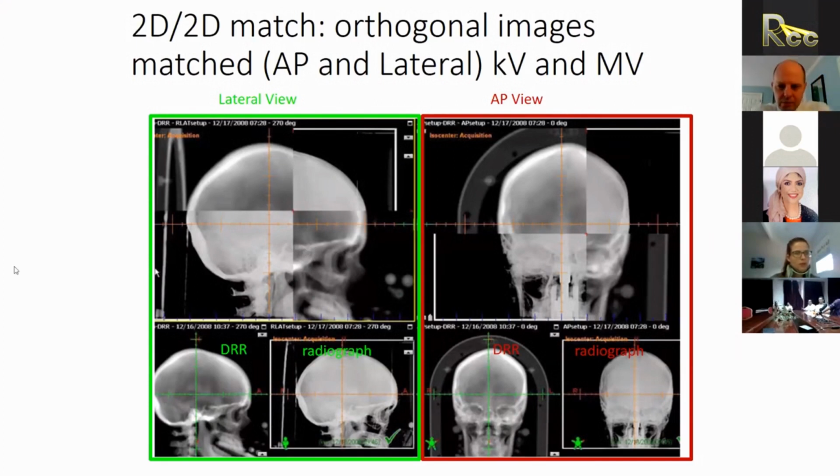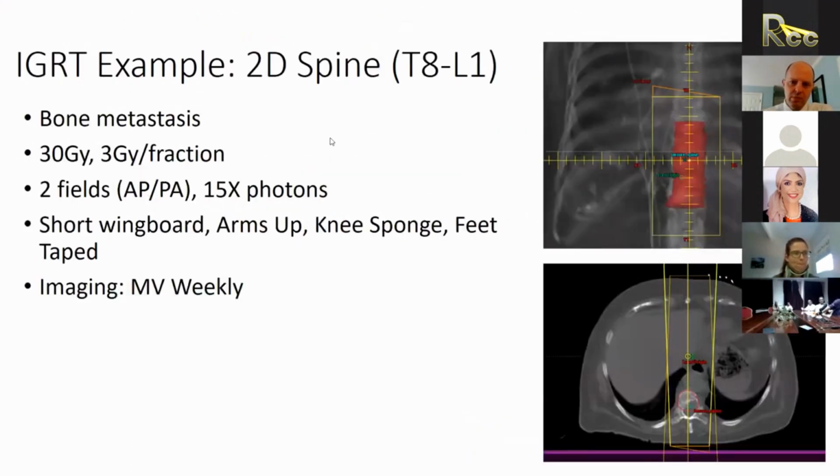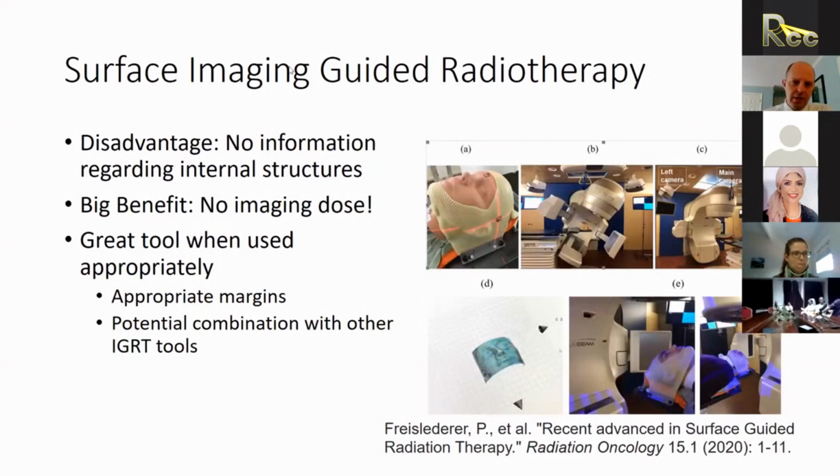Okay, Shaimat said, I didn't understand surface IGRT. What type of imaging do we take during setup, kV or MV? I think it's surface imaging. It's optical. Usually what happens is you can see this grid pattern. You have some sort of a grid that's projected on the patient from one light source, and then that's detected by an optical camera. It's not kV, it's not MV, it's optical. It detects the locations on the surface and creates a 3D map of the surface.